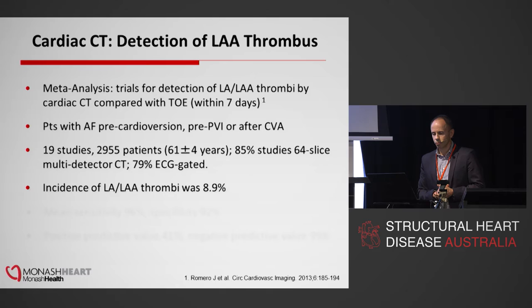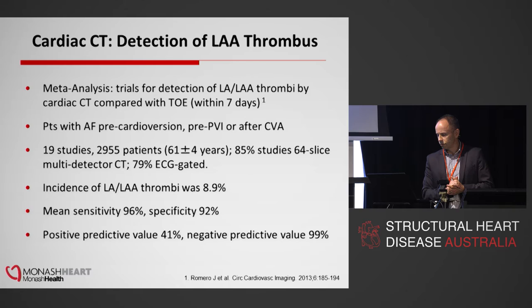This is a meta-analysis from a few years ago of 19 studies comparing TOE and CT performed within 7 days. And the incidence of thrombus in the LA appendage there was about 9%, and the sensitivity and specificity pretty good, 96% and 92%. But given that you've got a fairly low prevalence of thrombus, the positive predictive value is still a bit of a problem here.